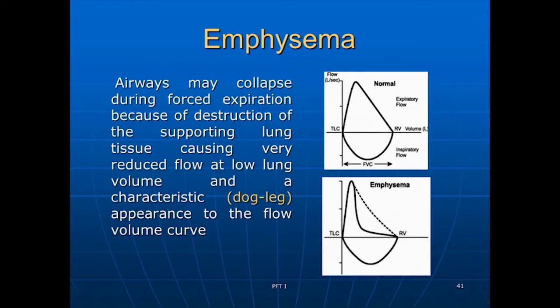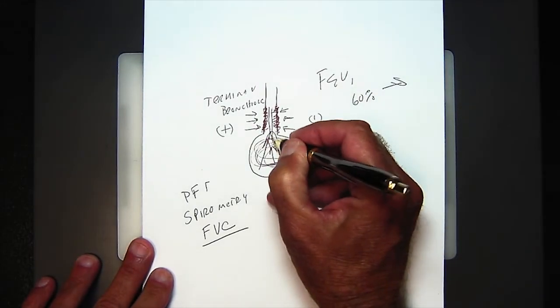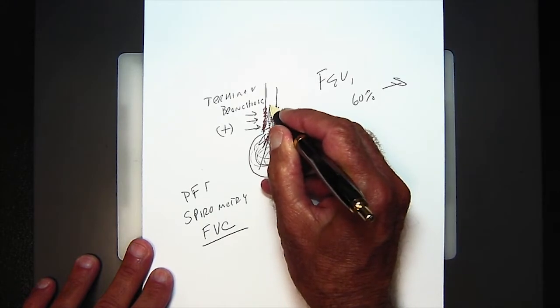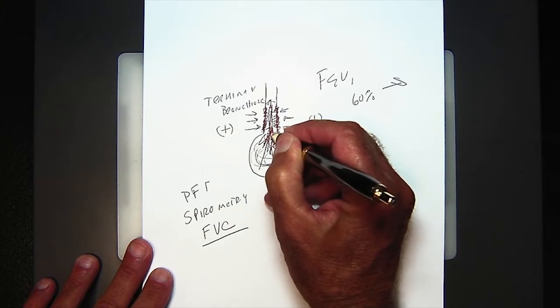So you see that during the forced expiratory rate, their flow decreases because they have this trapped gas in their alveoli. So this creates a lot of turbulent flow here. They can't get the flow out or the volume out as quickly as possible because this airway is narrow.